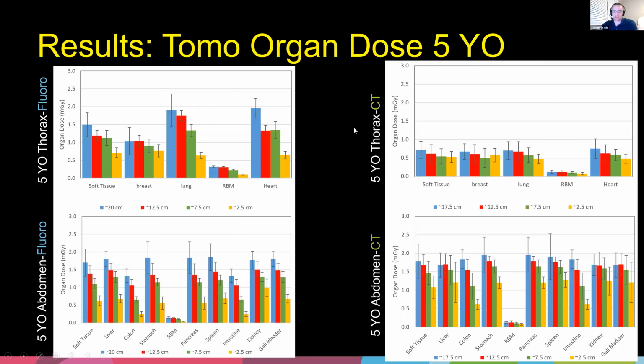So this is where you see that the CT itself, when you do just the normal helical scan of, say, the chest or the abdomen pelvis, is generally pretty low. The reason behind that is the tube current modulation, which we talked about many weeks ago. When the C-arm spins around the body, it does modulate. Every angle will be a different mA, but the difference is the field of view is this big, versus on CT it's teeny. It's only a couple millimeters wide. And so the CT scanner can modulate much, much better.